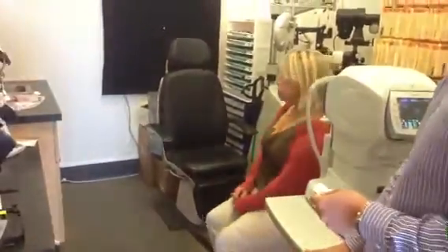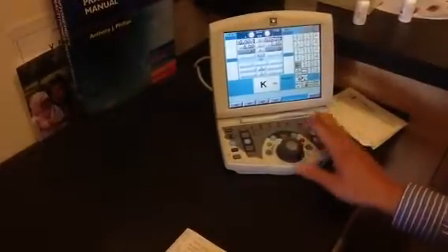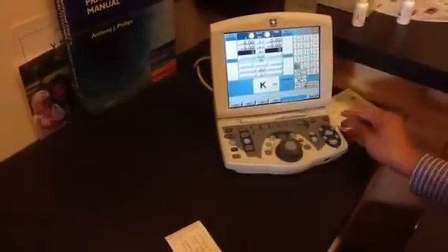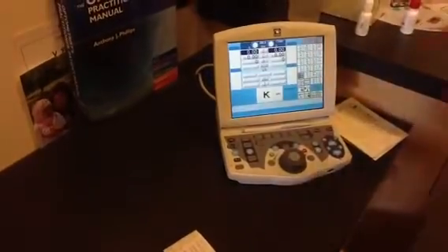Go ahead and have a seat up there on your bench. We'll come over to this machine here. The machine will be on when you come into the office. All you have to do is press any button and it will come on. If you want to clear the machine — if there's something on there — just press Clear, then press Yes, and it will clear everything.